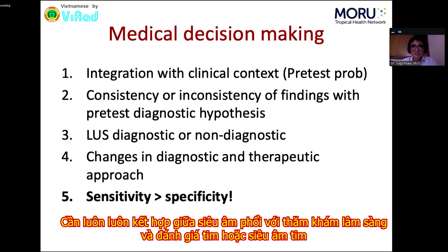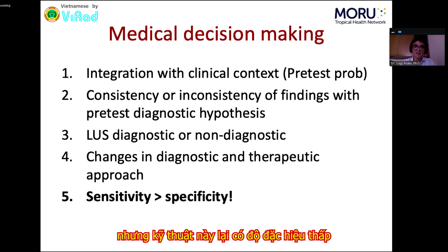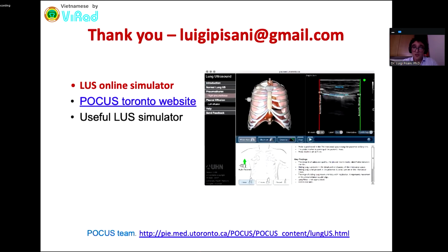Always integrate lung ultrasound with the clinical context and with the assessment of the heart, with echocardiography. Lung ultrasound is a very, very sensitive technique, but it lacks specificity. So our work is to increase the specificity of lung ultrasound. Thank you very much.